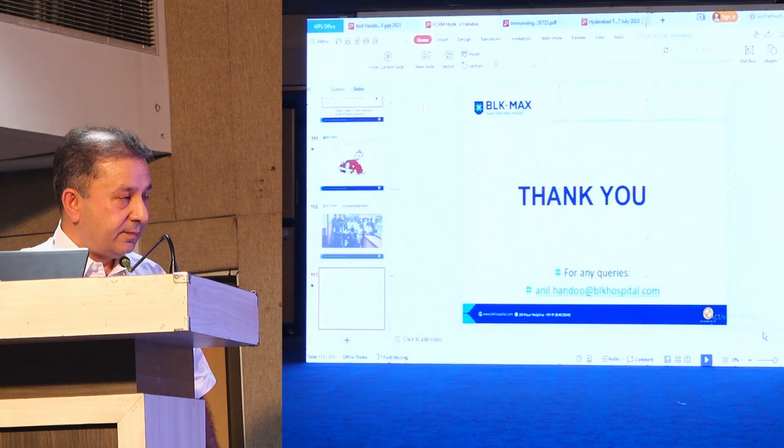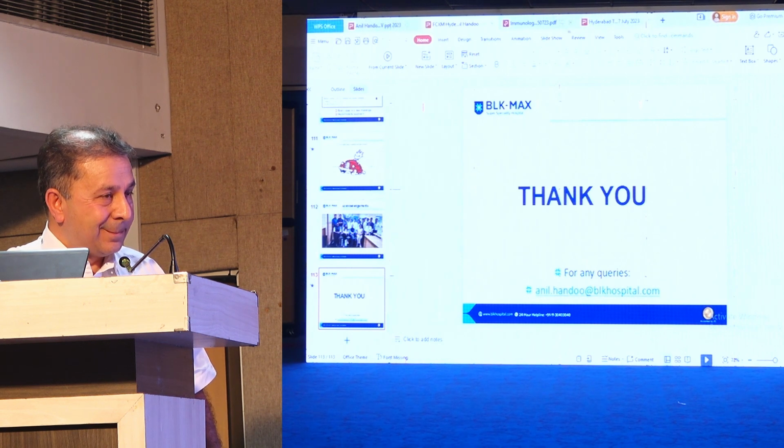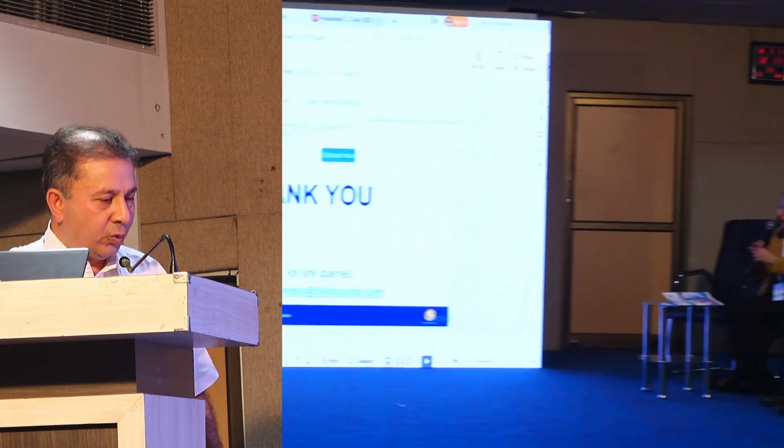When do you do endothelial antibody tests? Is it routinely you do, or? No. So in our center, endothelial cross-match is not done as a part of routine. Dr. Shruti apparently is doing it in her center in certain selected cases.